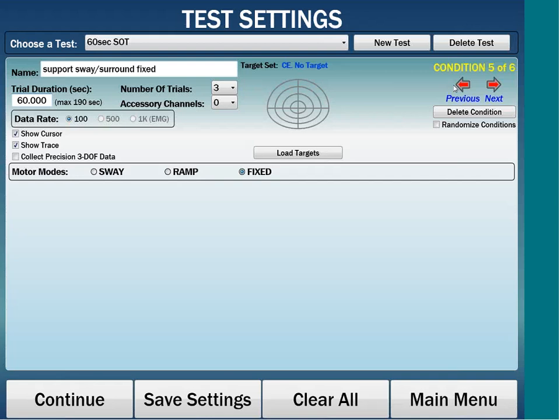In contrast to the CR system, there is a wealth of integration options for accepting signals from other devices, outputting to other devices, as well as initiating ramp conditions, etc. Quite the system. That will conclude this case study.